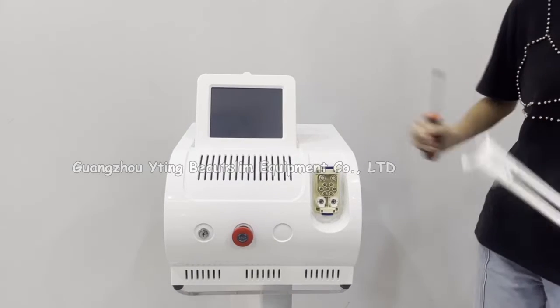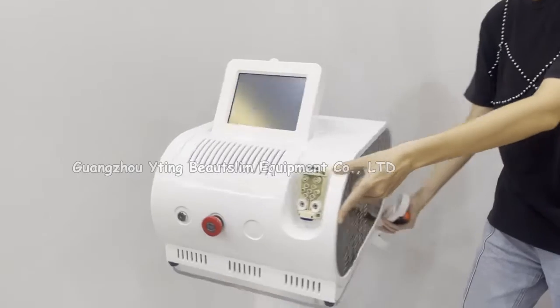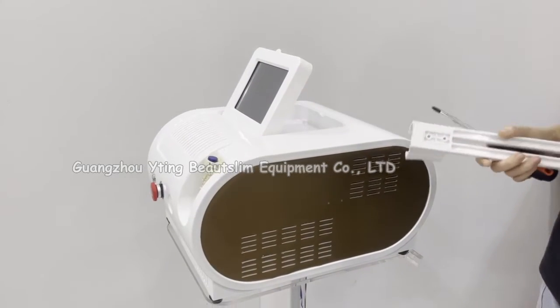Now we install this IPL machine. Firstly, install the handle holder. Use two screws.